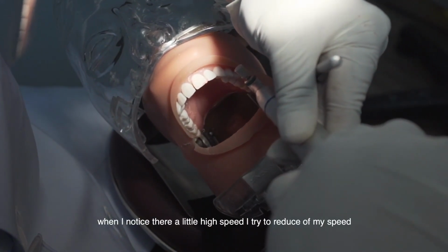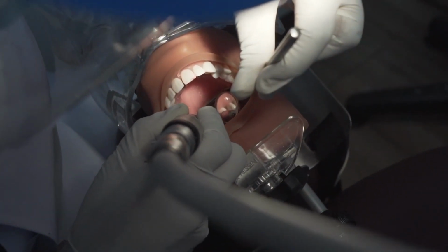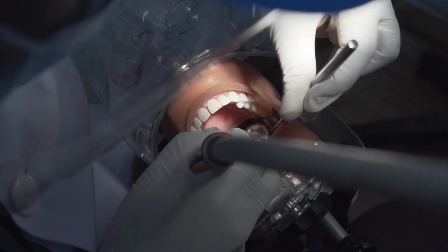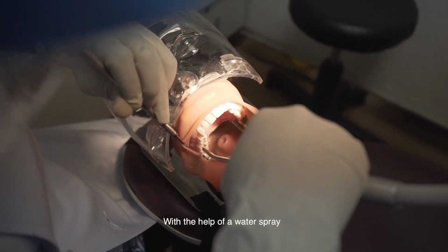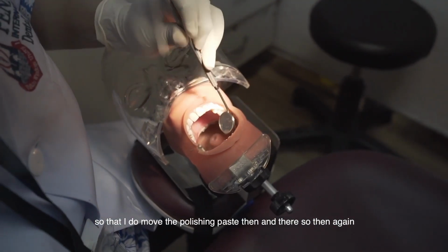When I notice the speed is getting high, I try to reduce my speed. Irrigate it with the help of a water spray so that I remove the polishing paste then and there.